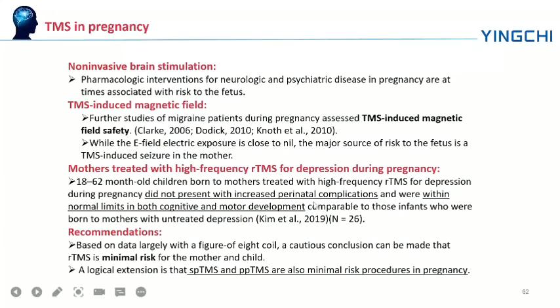And this study shows that mothers treated with high-frequency rTMS for depression during pregnancy did not present with increased perinatal complications and were within normal limits in both cognitive and motor development.